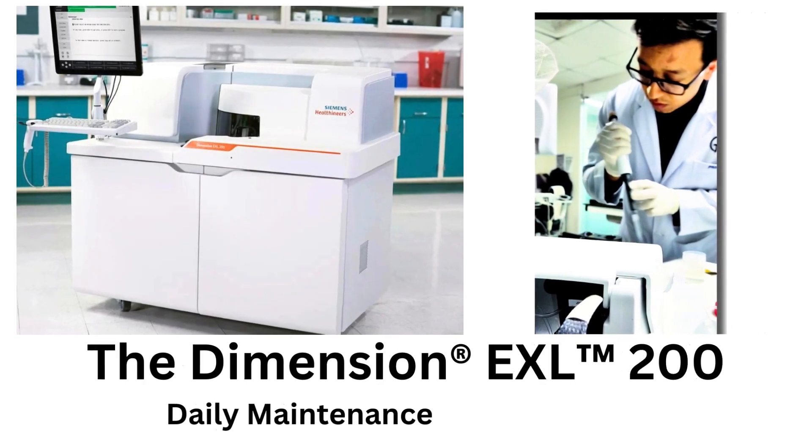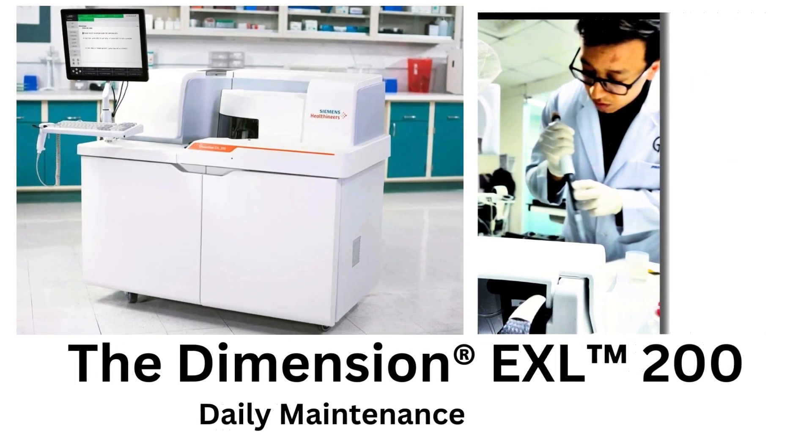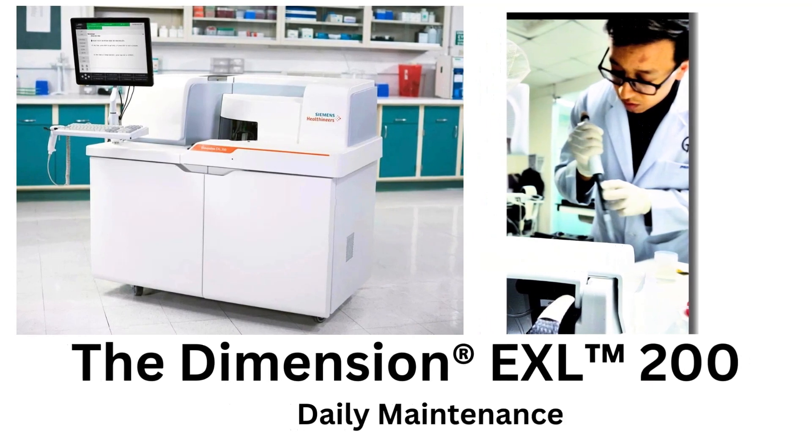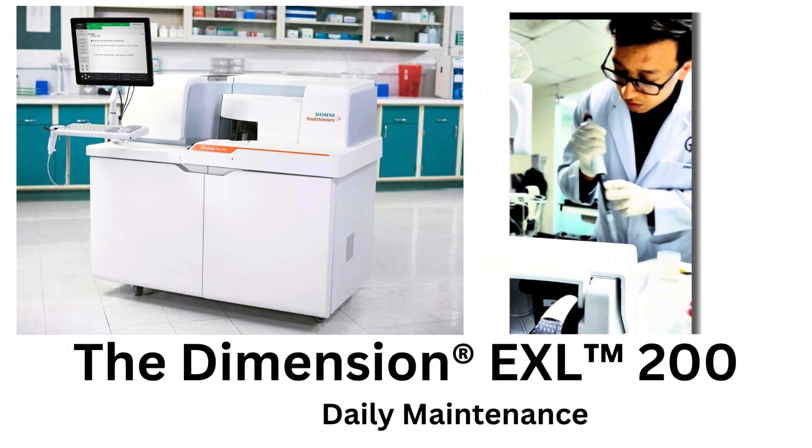Hello and welcome you all. I have come up with this daily maintenance tutorial for laboratory professionals using Dimension EXL 200. As daily maintenance is an integral part of quality assurance, it becomes crucial for us to perform it on a daily basis for better performance of the equipment so that it can deliver accurate and reliable results.